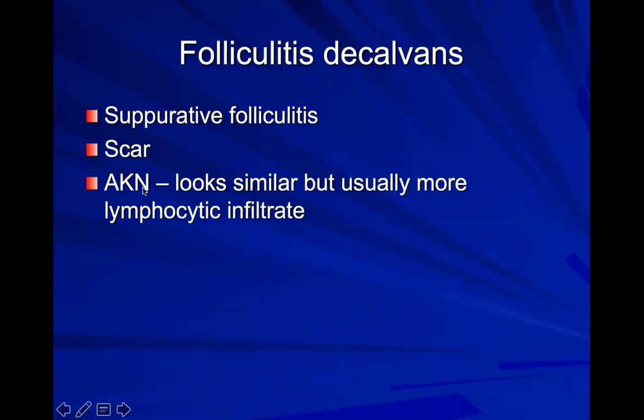Acne keloidalis can look very similar if you're in the stage where the follicle's been destroyed and now the hair shaft is exposed to the dermis, which, remember, is then foreign material, and your body mounts an inflammatory response. That inflammation can look similar, though usually it begins more lymphocytic, the way acne does, as opposed to very suppurative, the way folliculitis does. We'll review the differences between those in the next section.